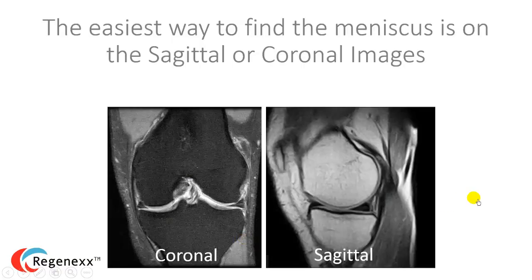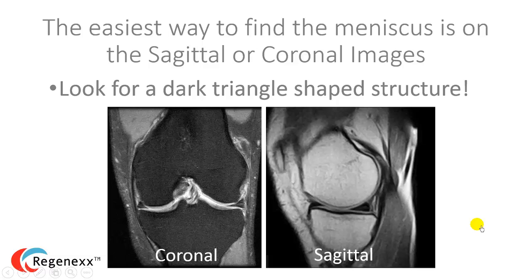The easiest way to find the meniscus is on the sagittal or coronal images. Look for a dark triangle-shaped structure. You can see these triangle-shaped structures here, and on the coronal or sagittal, the meniscus will always look like a triangle — at least the normal meniscus. I'm going to highlight those triangles right here.